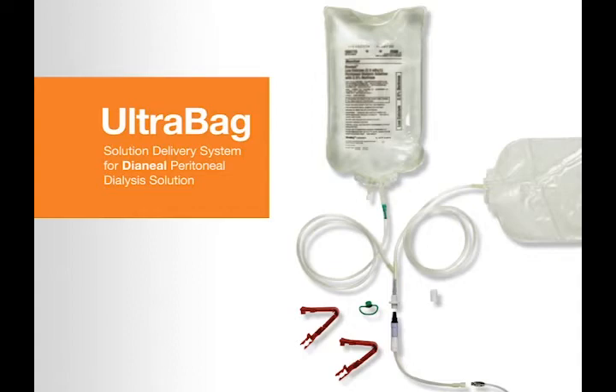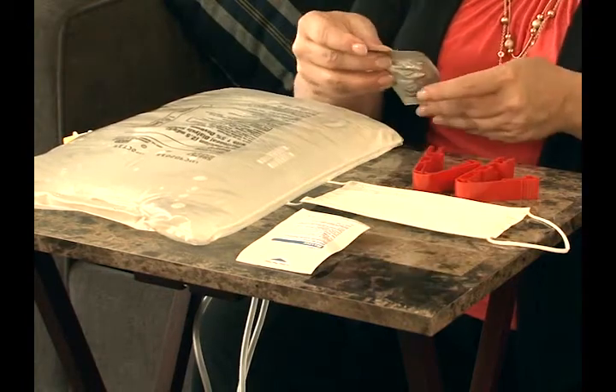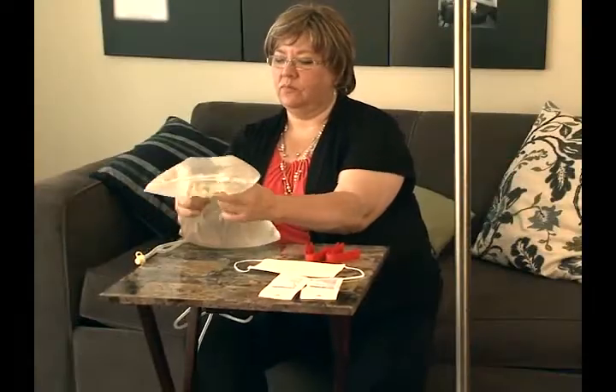First, we will take a look at the main components of the UltraBag system and outline the steps for using them. Later in the video, we will review each of these steps in more detail.